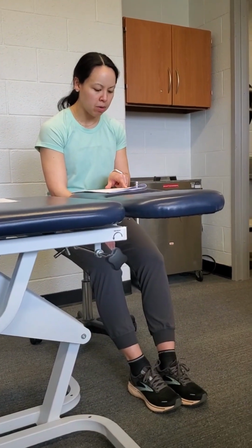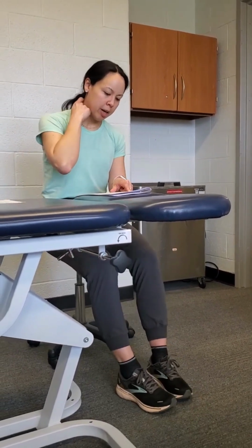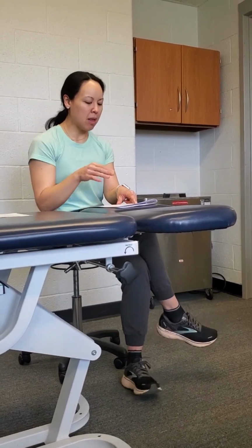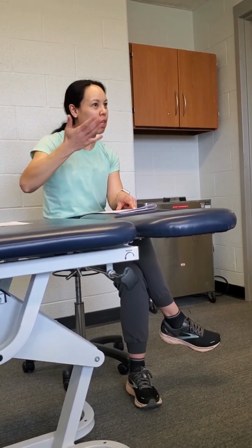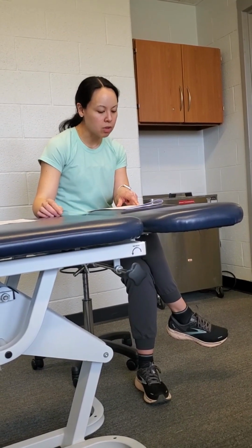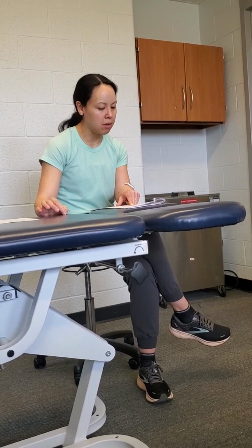It also talked about upper extremity. It said 40% limb occlusion pressure, which is pretty typical for upper. They didn't really know what the top range was for that, but they said 40% is generally where you use it. The intervals are a little bit different: 5 to 8 minutes on, 1 to 3 minutes off, and you do 3 bouts of that.